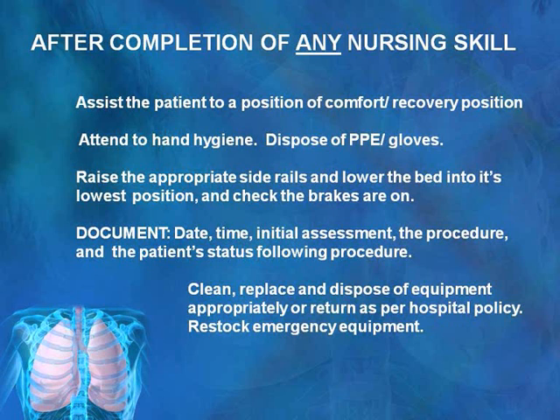Documentation is incredibly important. And ensure that you clean, replace and dispose of all equipment, making sure the resuscitation trolley is restocked.